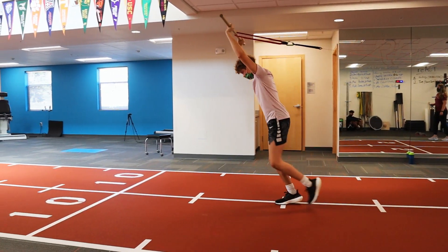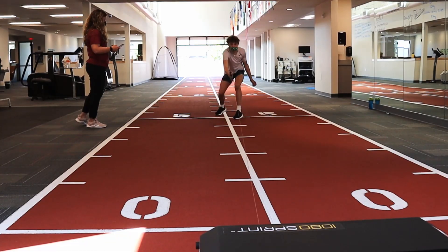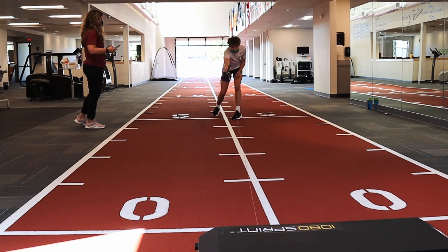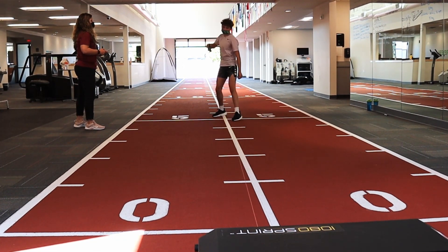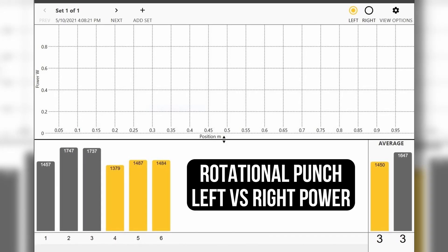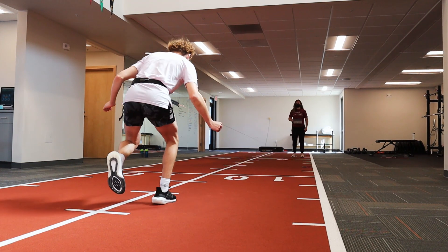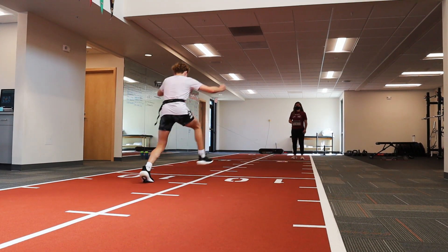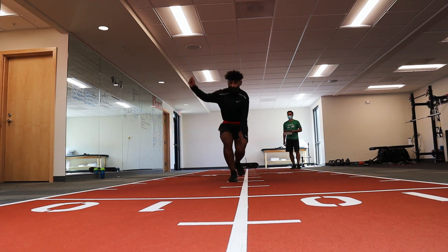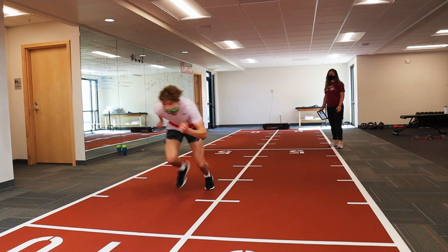Once we're able to do that, it really opened the door — this machine isn't only for people who are running, jumping, and sprinting. This machine can be for people who are swimming, throwing a football, throwing a baseball, throwing a javelin — all these different types of things because of the uniqueness that the 1080 provides. We want data. We want to be able to objectively measure and say we're not quite ready, but here's the goal, this is what we're looking for, we're going to get you there, and we're going to keep measuring this until we get to that goal.